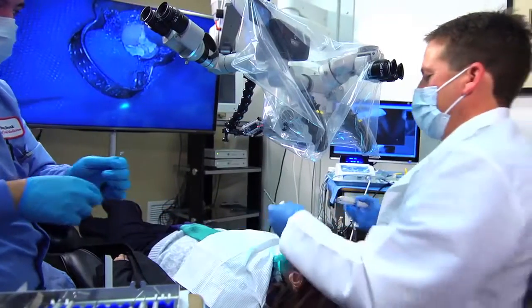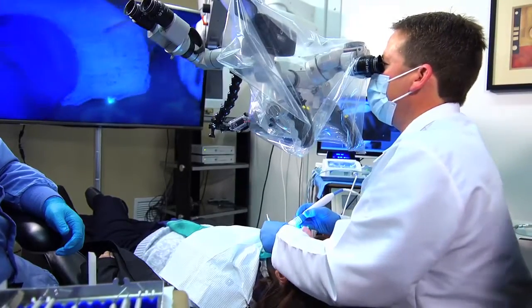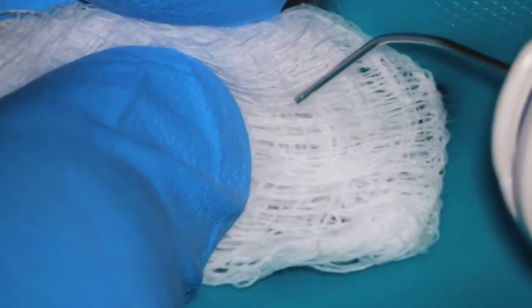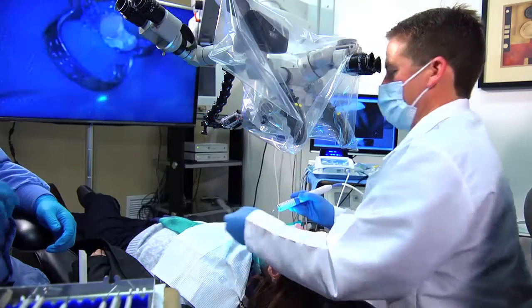Next, I'm going to prime my needle. You always want to prime your needle so you don't have an air pocket when you place it down inside your canal for releasing. Just sit here and actually get it so you know that it's about to come out of your needle. If it doesn't, you're going to have an air pocket when you initially squirt.